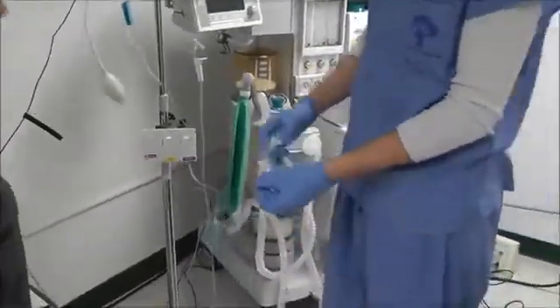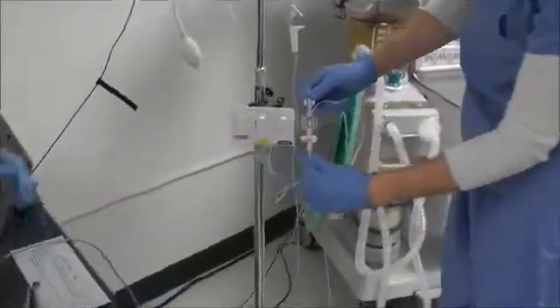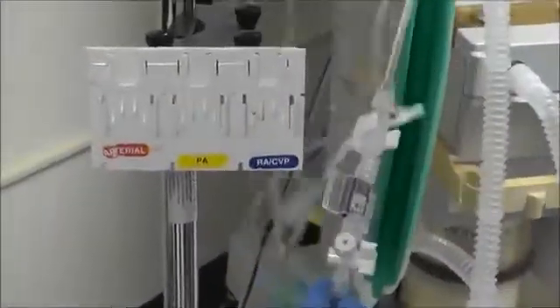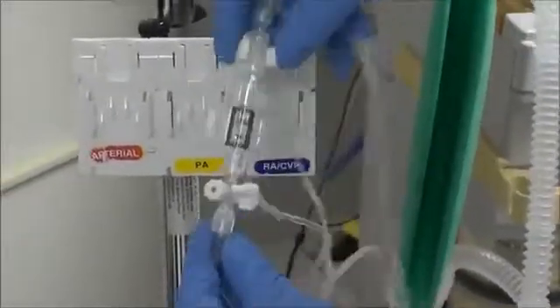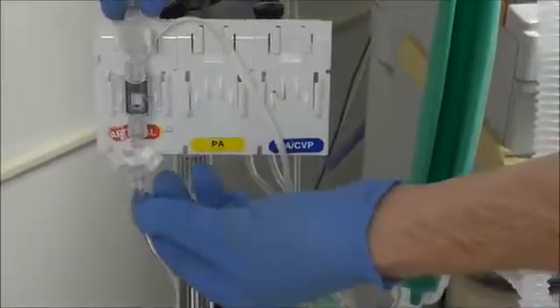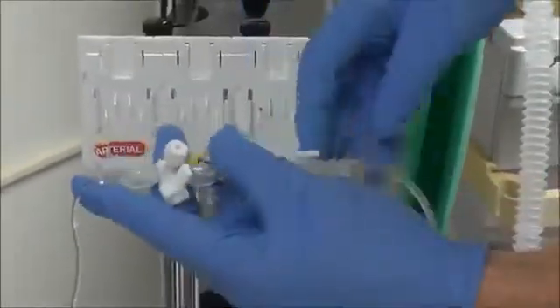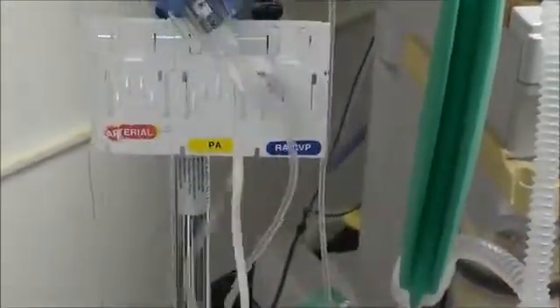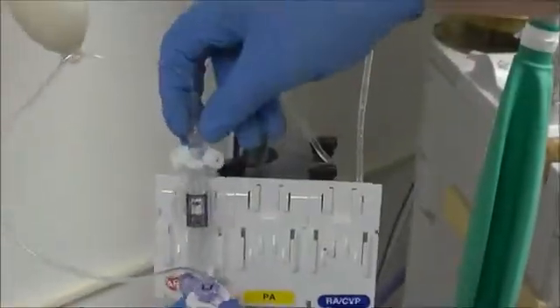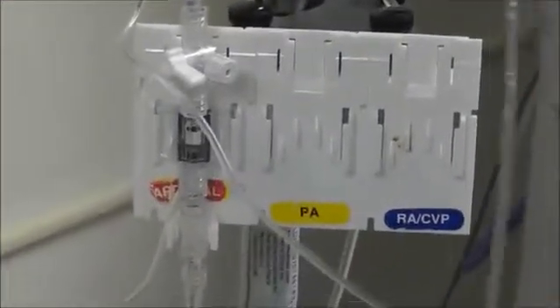So, before we do that, if you come down and get a close-up to the transducer holder, we need to hang this transducer tubing. It just sits in right here. But there's a right and a wrong way to do this. When you hang this transducer tubing, you want to make sure that the tubing that's going to go to the patient is facing upwards, and that the cable for the transducer is facing downwards.